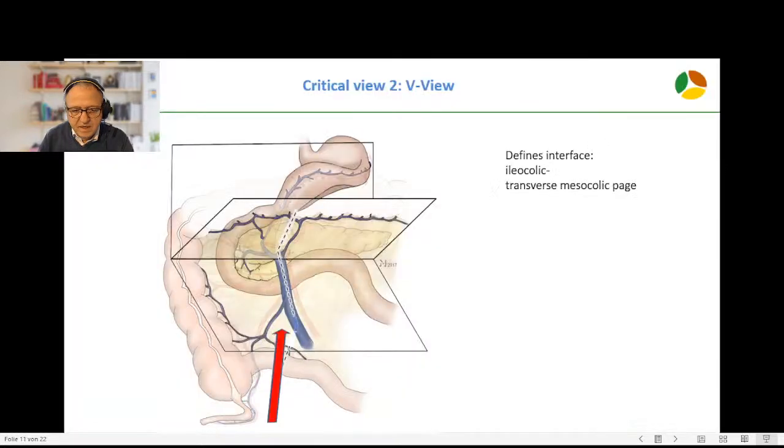Now we have to change position, head up, tilt to the left. Critical view number two is the V-shaped configuration of the iliocolic vessels with the superior mesenteric vessels. We head for the incision point located between the angle of the SMB and the iliocolic. We're not going directly next to the iliocolic vein in order not to injure the lymphatic tissue.